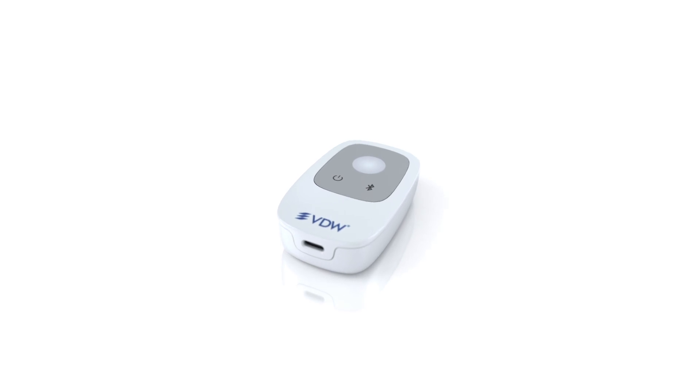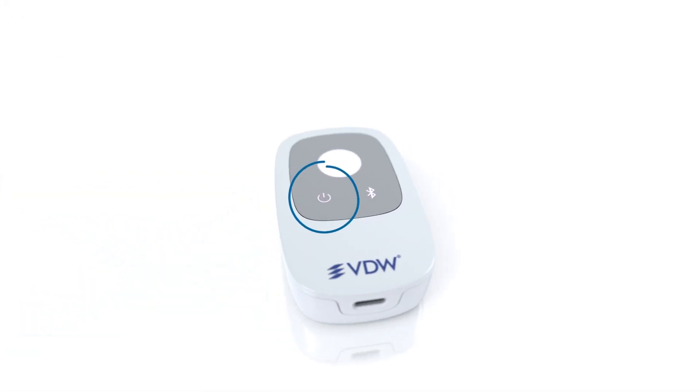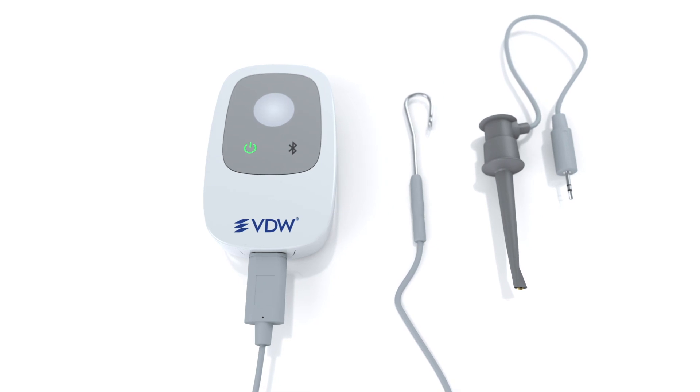To start the VDW Connect Locate, you have to press the power button. This button is on the device next to the Bluetooth button. When the power on button is green, you're ready to go. There is no need for calibration.